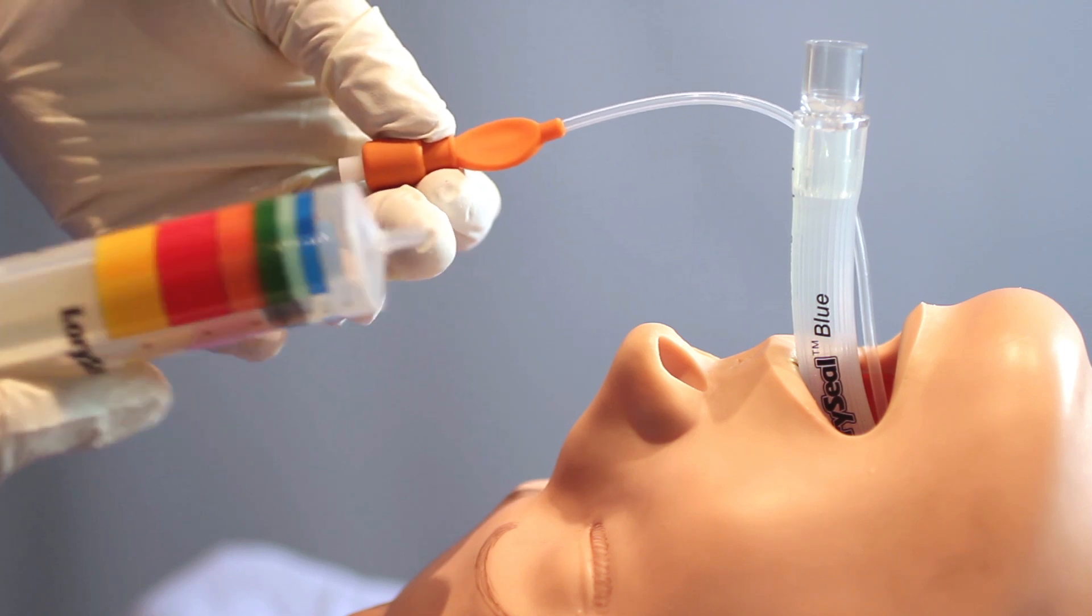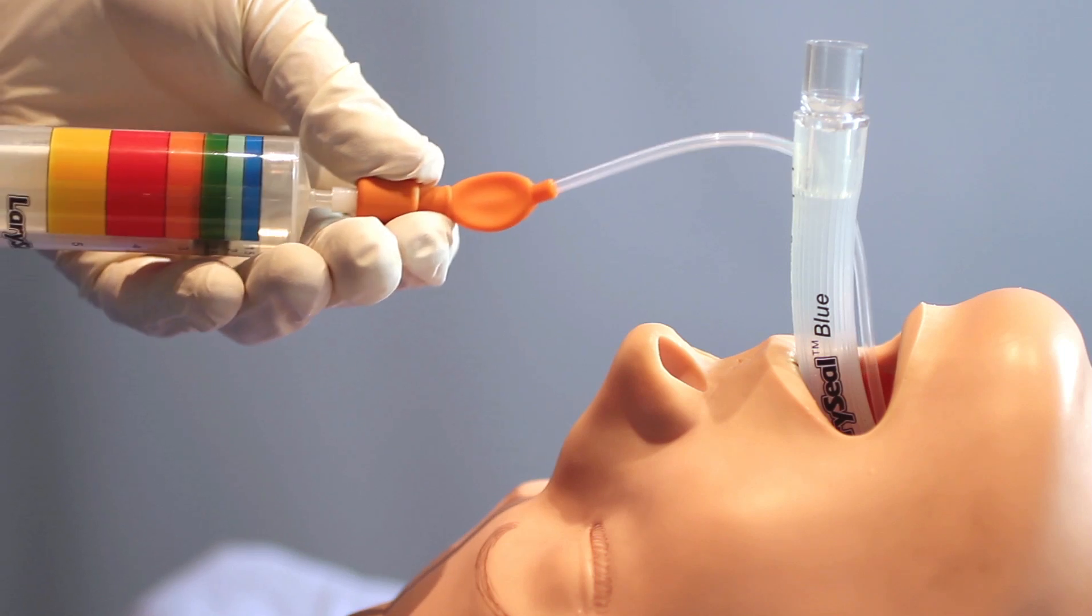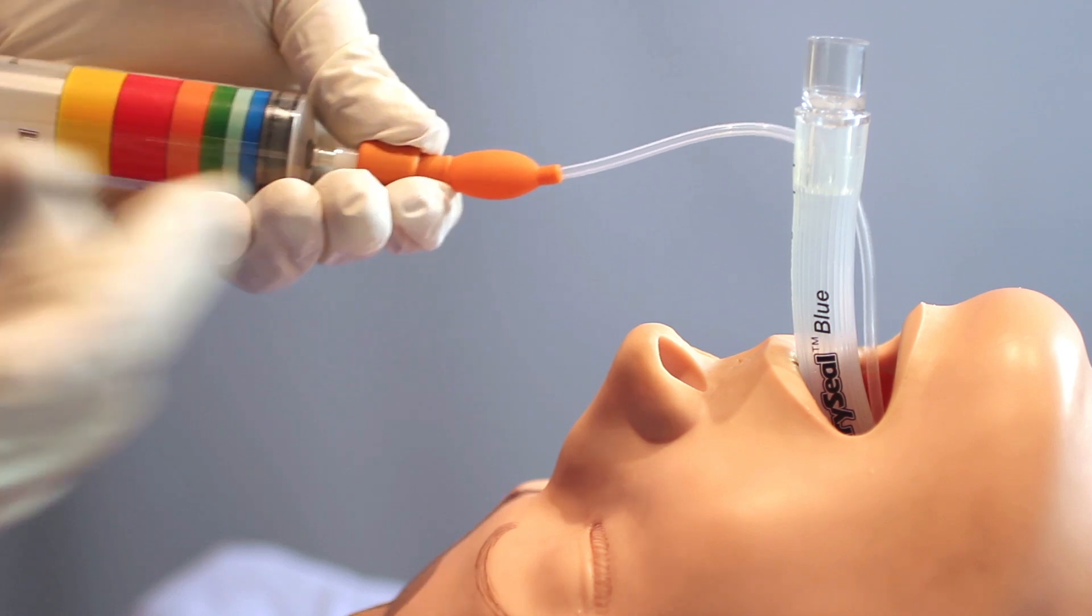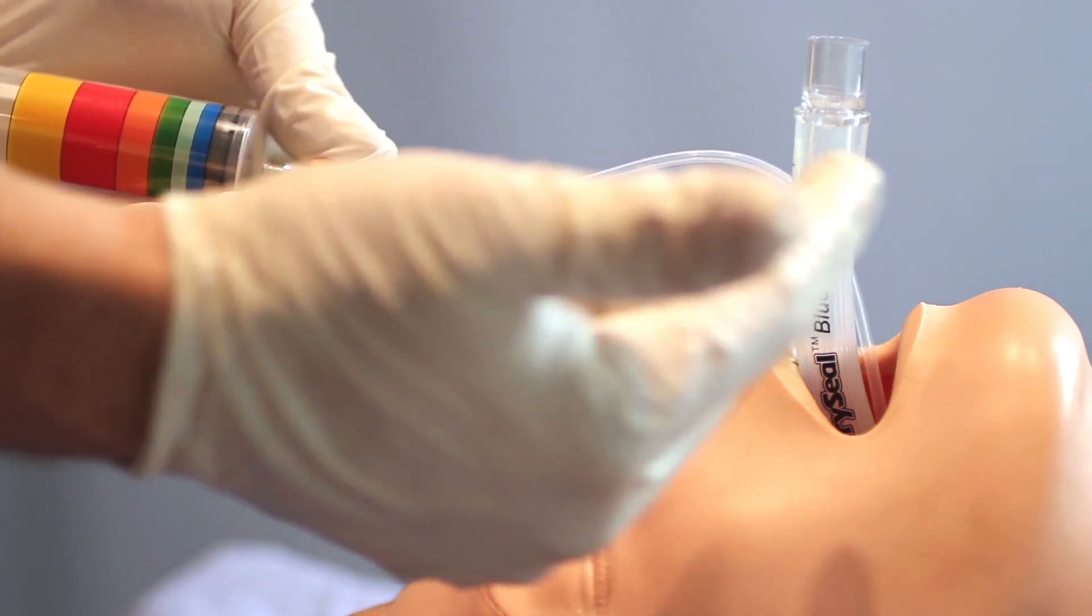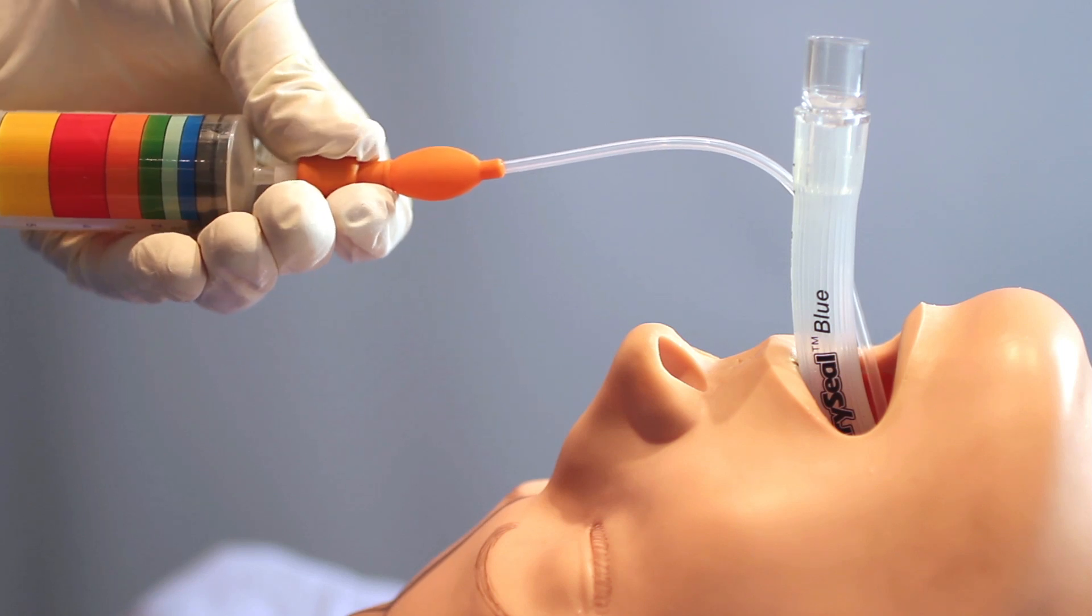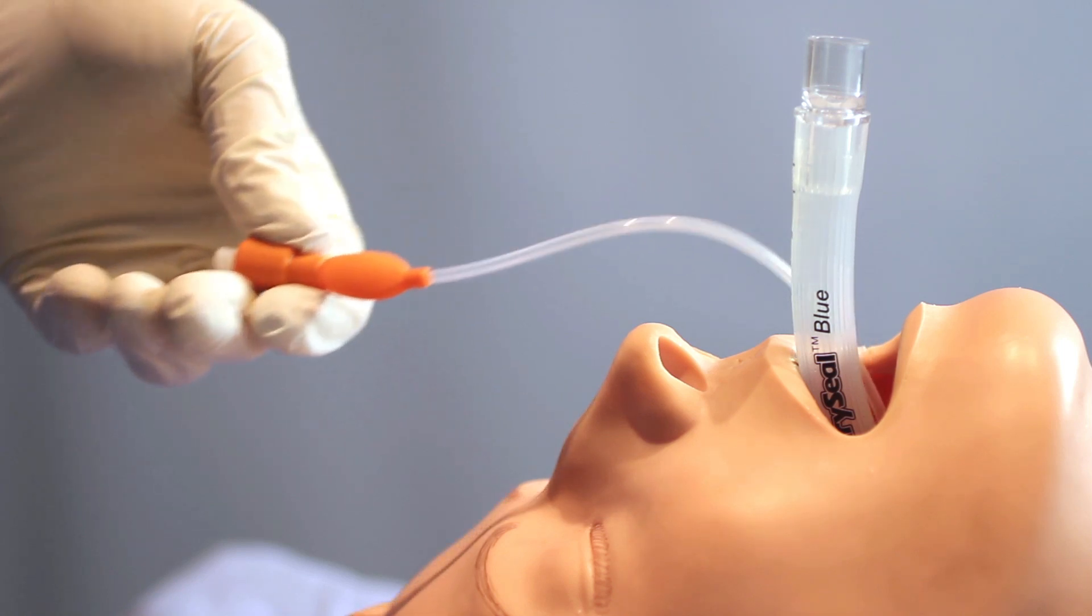Match the color of the Laracel cuff inflator to the color of the pilot balloon and insert one third of the maximum volume to seat the Laracel Blue. Some movement of the main tube is perfectly normal and this can be taken to mean that the Laracel is correctly placed. Adjust the cuff volume as necessary.